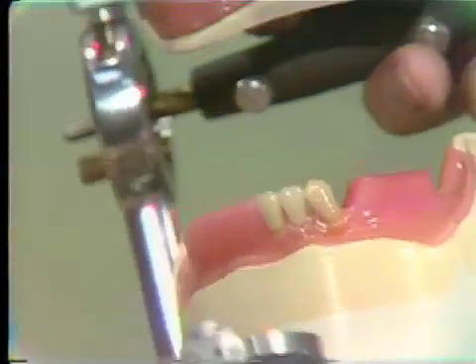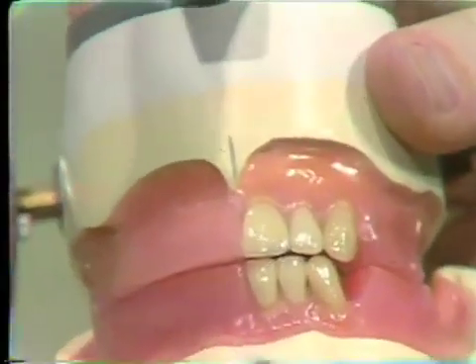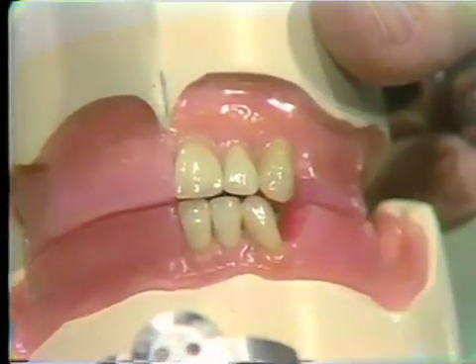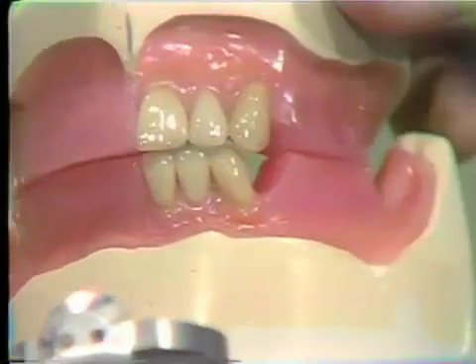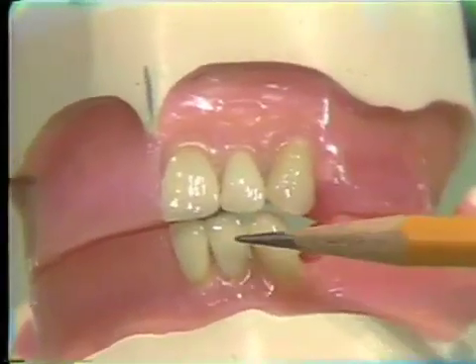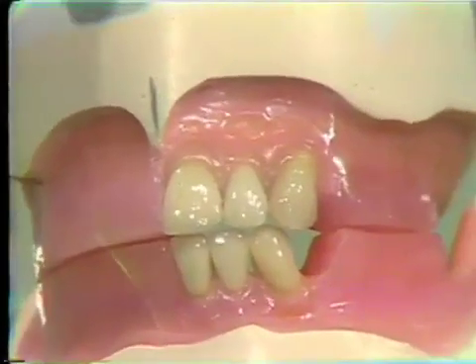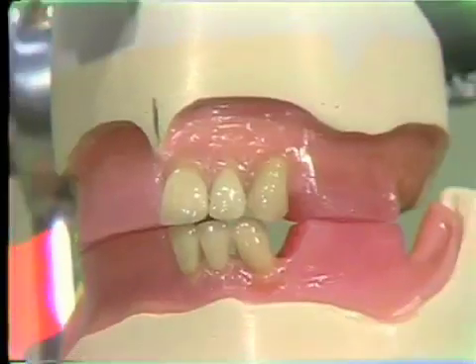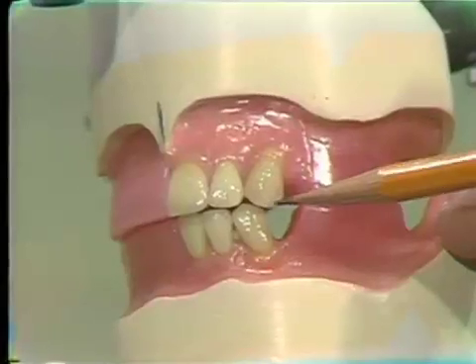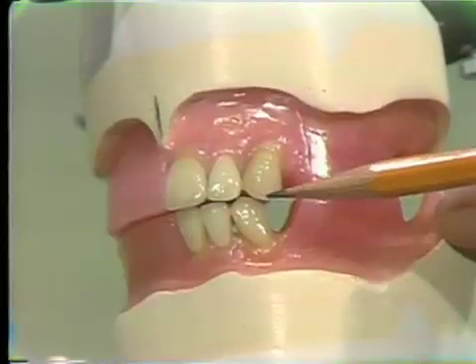Now when I close the articulator at this point, let's look at the features that we should see at this time. One is that we have our millimeter overjet and overbite. In the central incisor we have the 1 millimeter overbite. But because the maxillary lateral incisal edge is set at the plane of occlusion, the same as the lower incisor set at the height of the occlusal plane, those teeth should be end-to-end, and indeed they are, as you can see. Again, as we go around to the cuspid teeth, we once again have the vertical overlap or overbite. And here again, we're talking in terms of a millimeter only.